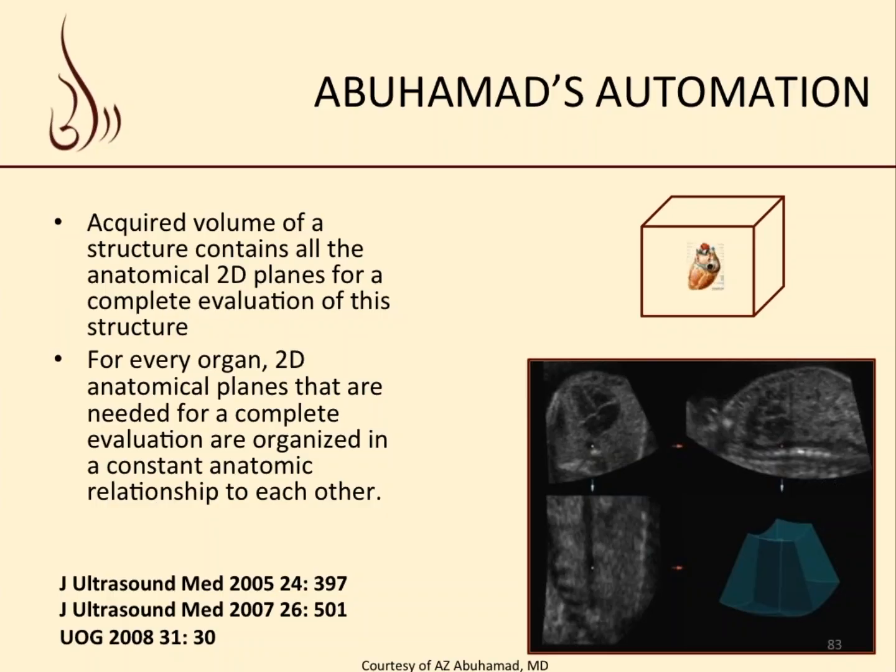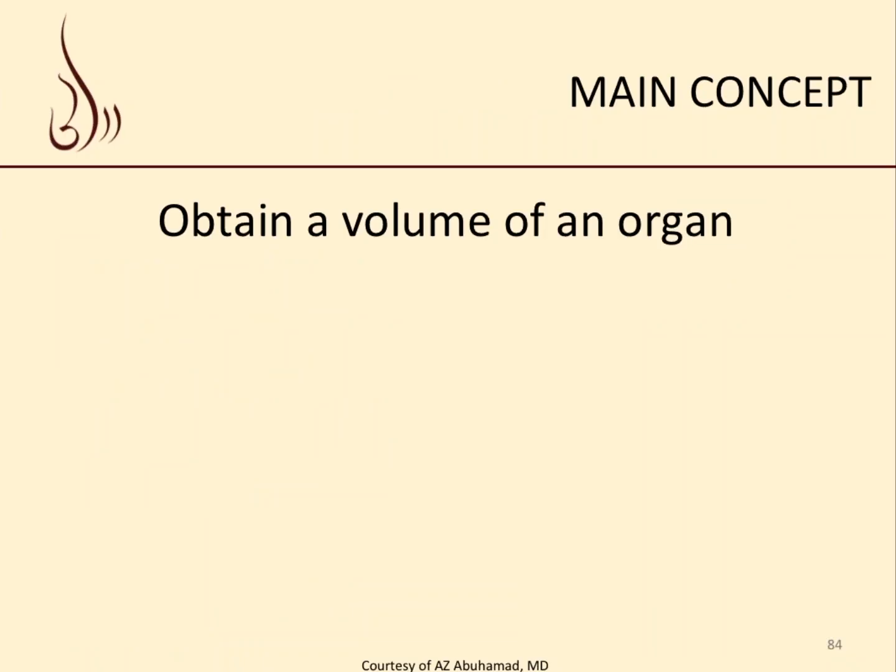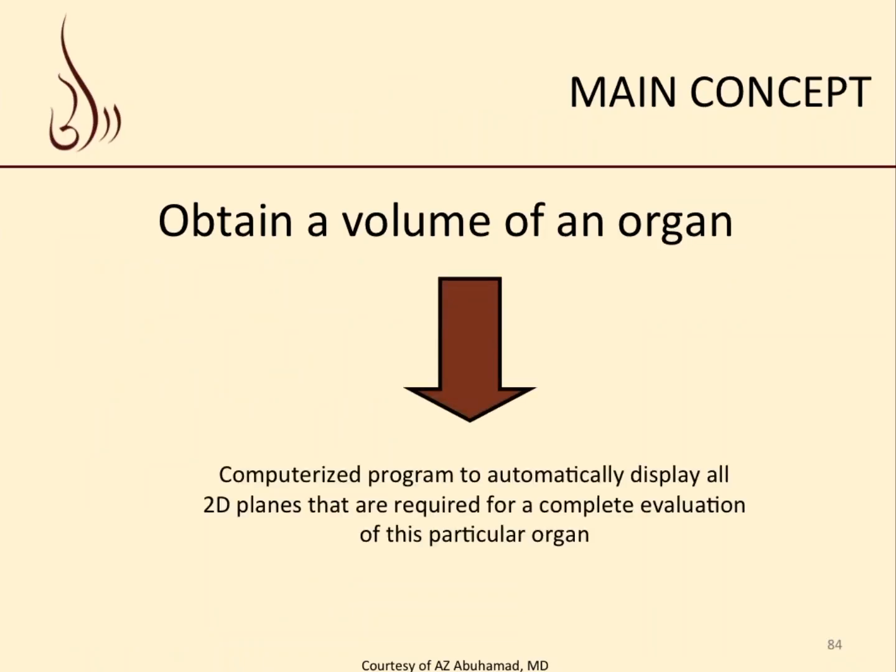This relationship can be defined, and you can then devise a software where you obtain a volume of an organ, and with the press of a button, the program will automatically generate these 2D planes for you for a complete evaluation of the organ. And this has been done with the fetal heart.